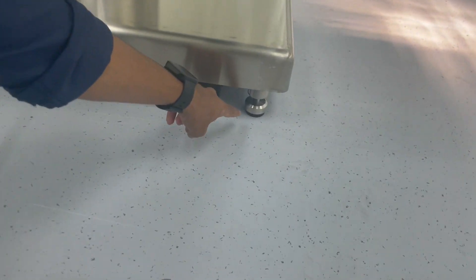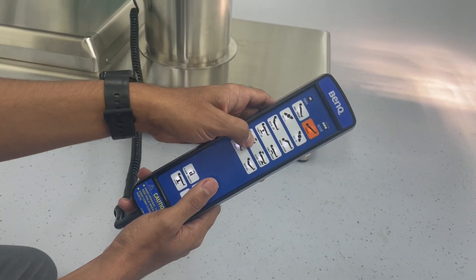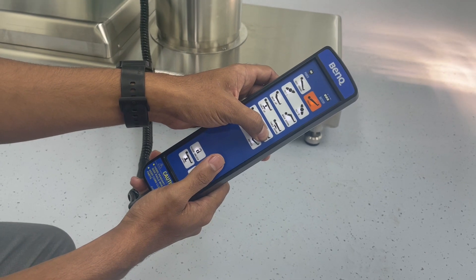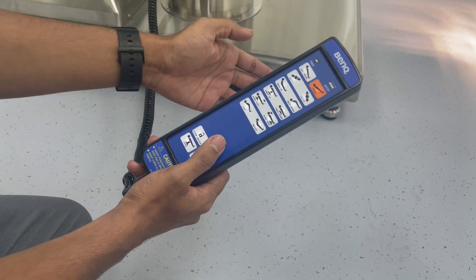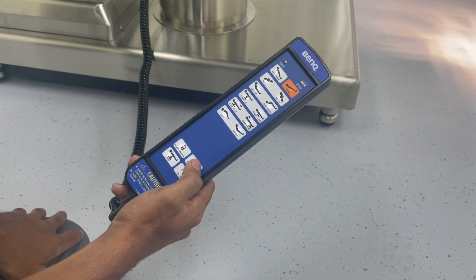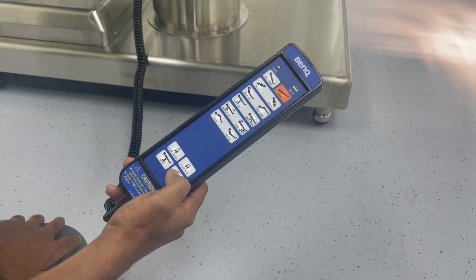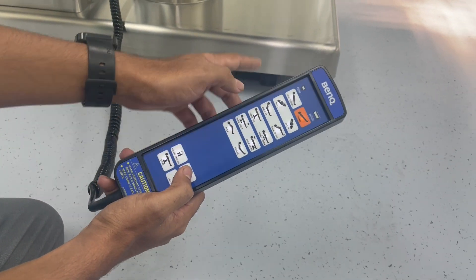First we need to show that the table is in a floor lock condition. In this condition only, functions work in a good manner. Otherwise, if the table is not in floor locked condition or in a floor break condition, it will not work.